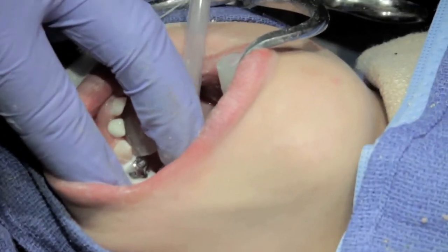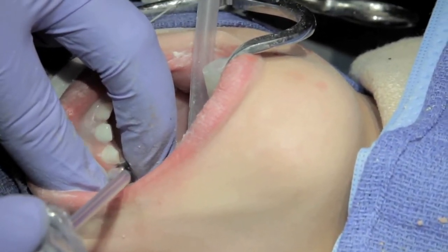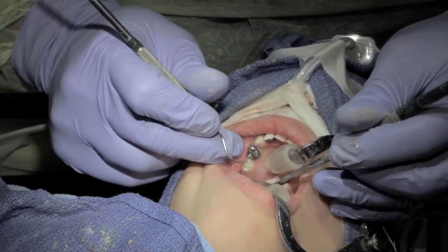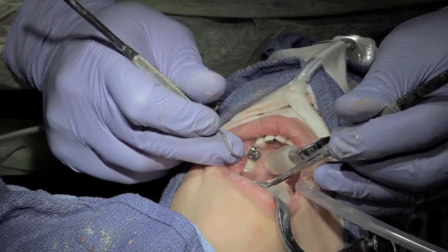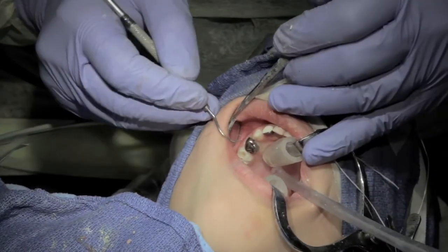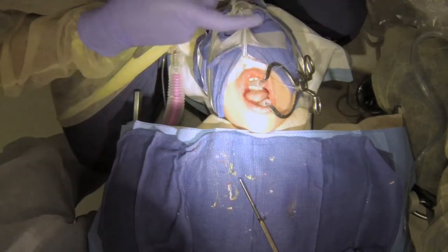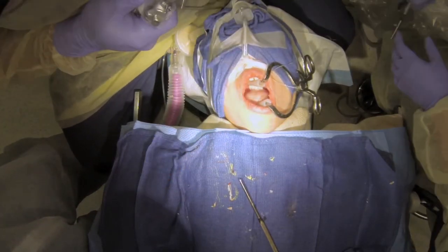Make sure it's seated all the way. Check for excess cement. That's all she wrote — beautiful.